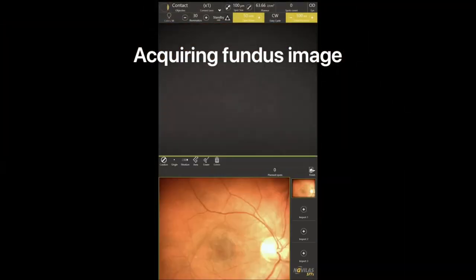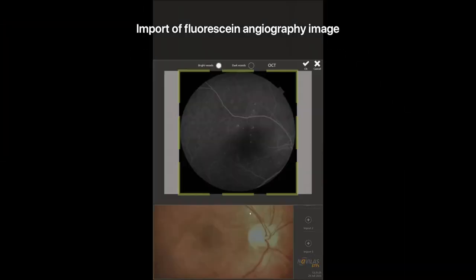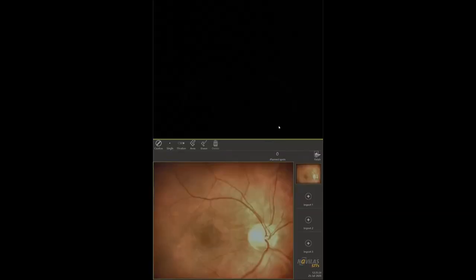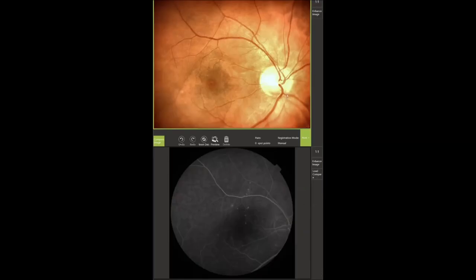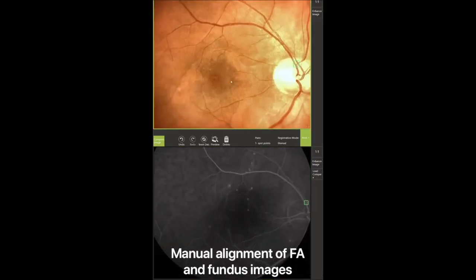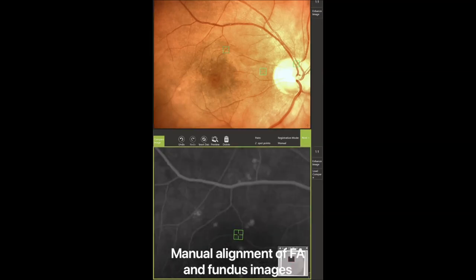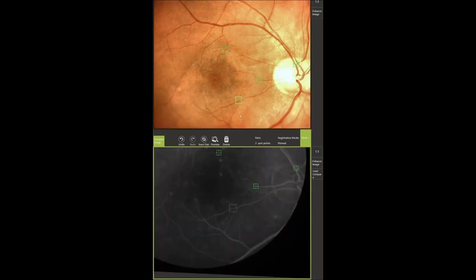First, we acquired a fundus image on the Navilas system with the non-contact objective of the central retina. Then we imported the fluorescein angiography image where active points of leakage were sharply visible. After that, we chose manual alignment, as it seemed to us more accurate.